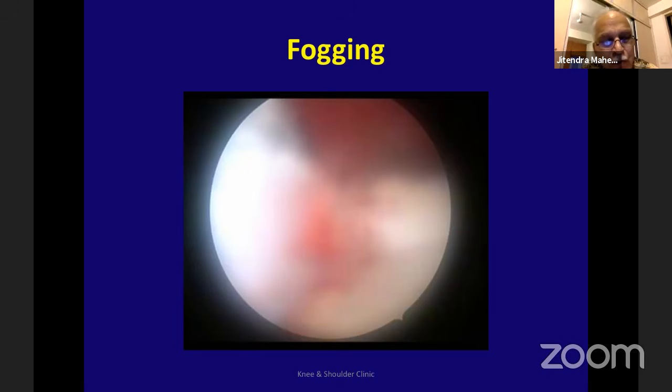Suppose you're doing arthroscopic surgery to prevent that so-called complication of an atherosclerotic vessel, and it starts bleeding and you can't see anything. What is the point? So over a period of time, you get used to working without a tourniquet, which is fine. But if you are a beginning surgeon, rather than trying to save that complication of a vascular injury, which is, to my mind, quite theoretical, it makes your whole procedure very difficult. Because arthroscopy is dependent on visibility. If you can't see, you can't see.